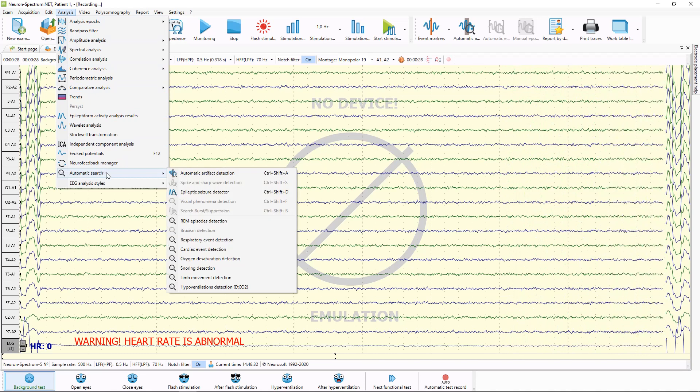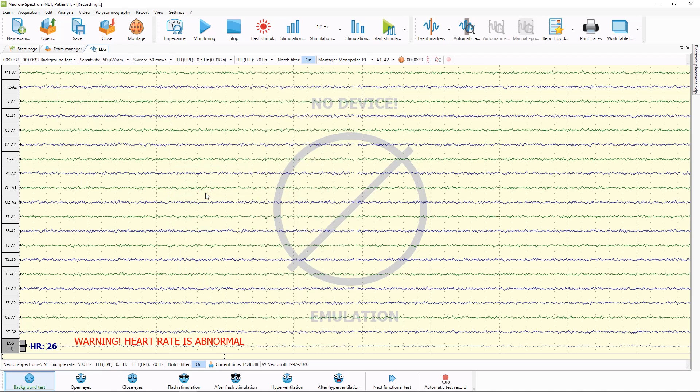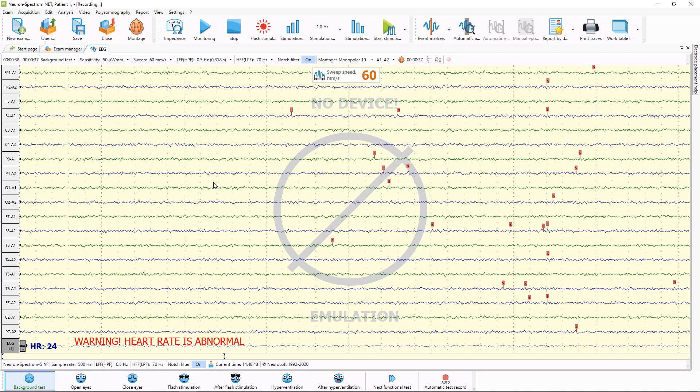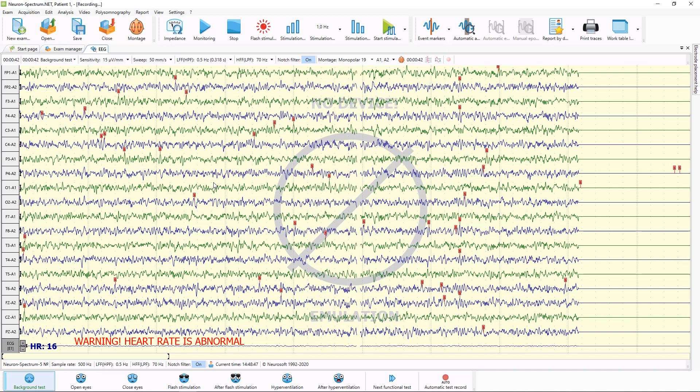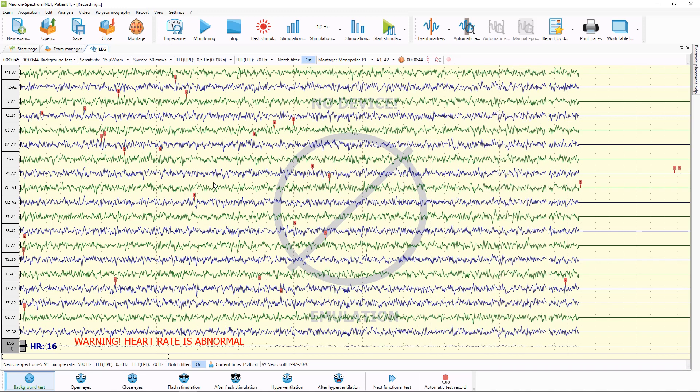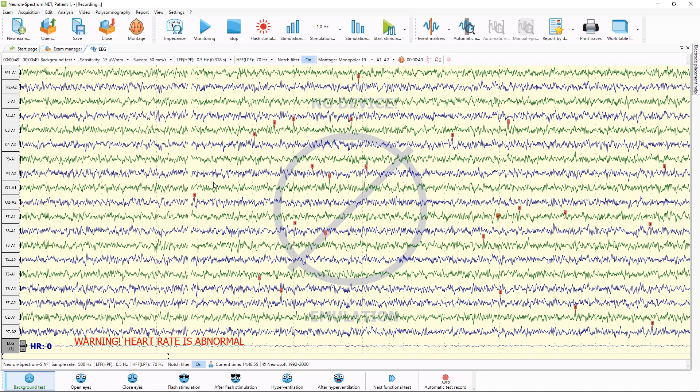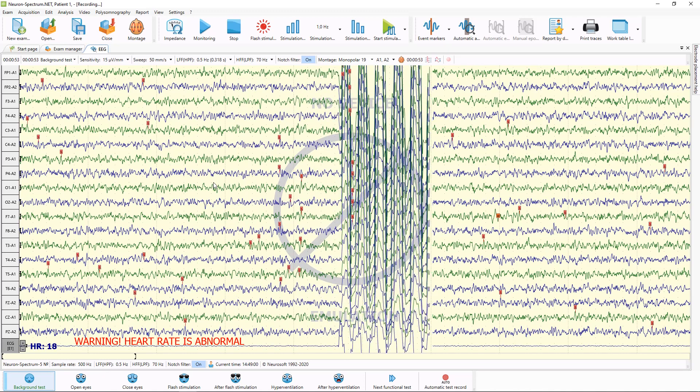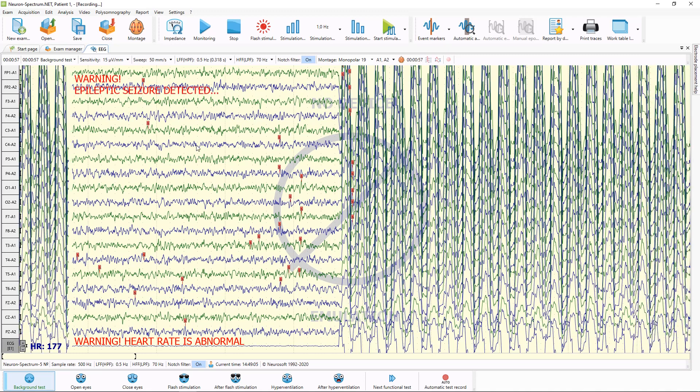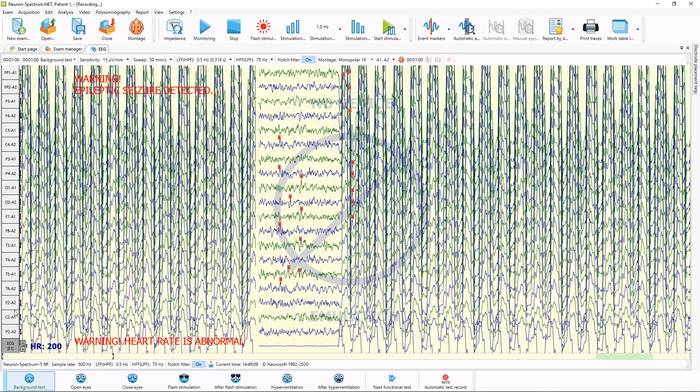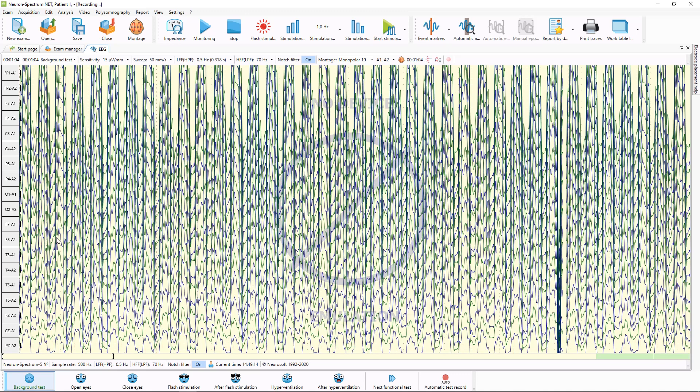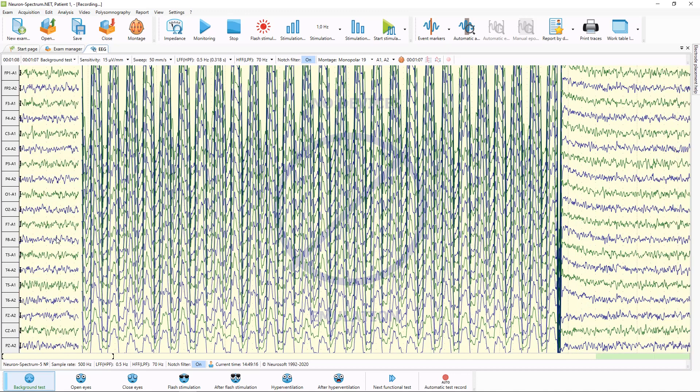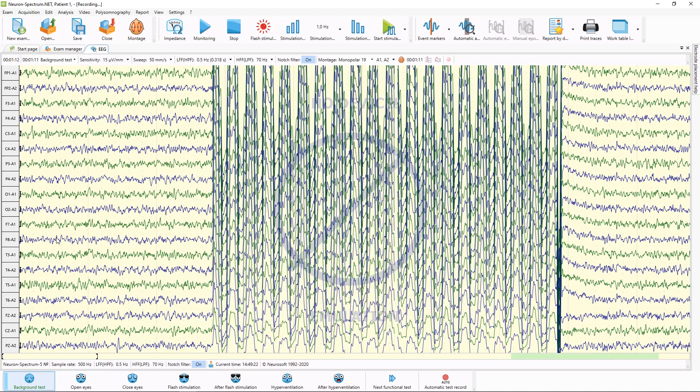During the acquisition, you can use automatic seizure detector. I will switch it on now. And now you can see that it finds spikes and sharp waves in online mode. And when emulation will emulate the epileptiform activity, the detector also finds it. Now you can see this red text and special sound. And after acquisition will be finished, all these epileptiform activity episodes will be marked by the software automatically.